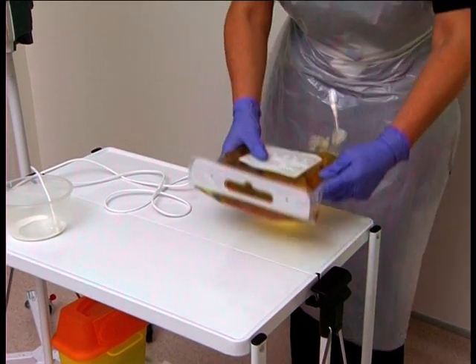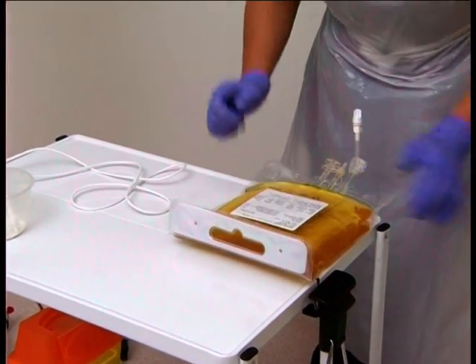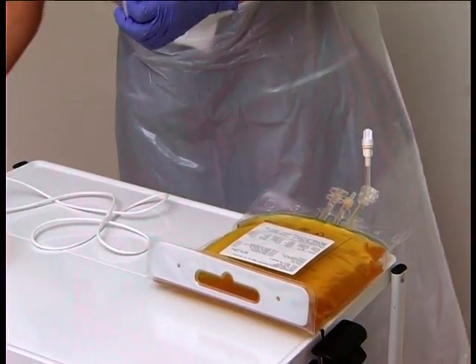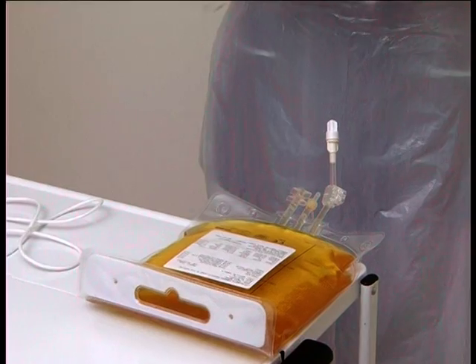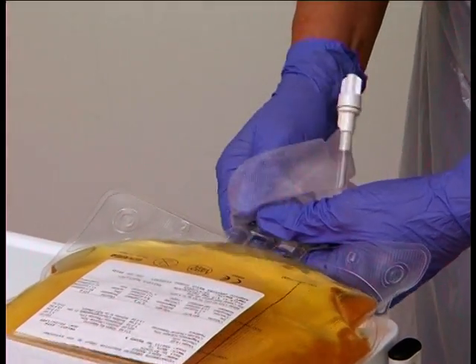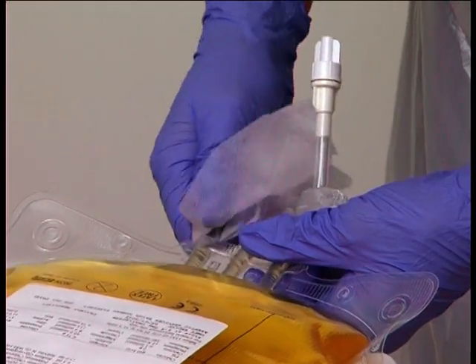Place the aqueous bag on top of the trolley with the connection ports facing towards you. Using a CHG wipe, clean the connection port where it will break open for 10 to 15 seconds, ensuring adequate application of the alcohol and chlorhexidine.